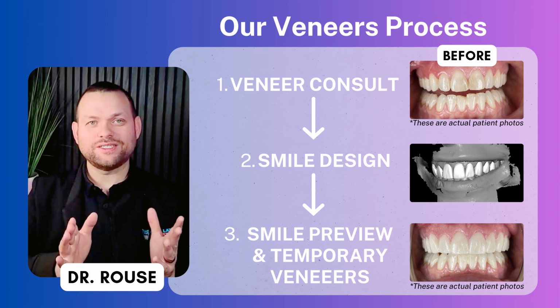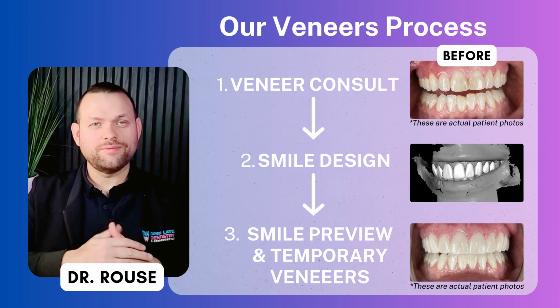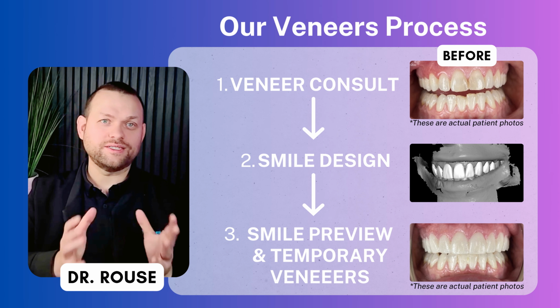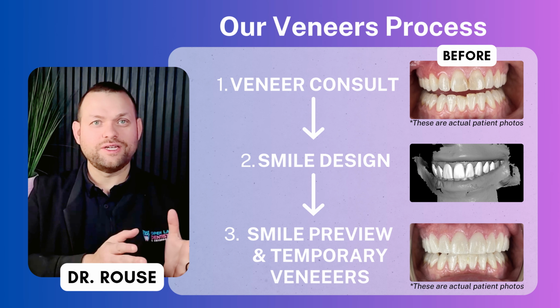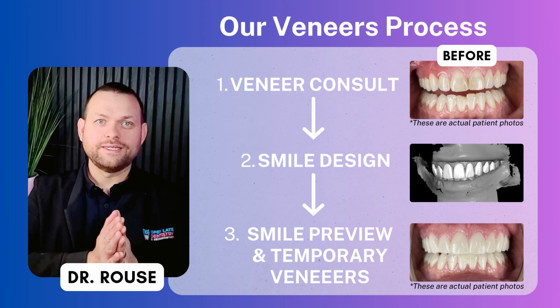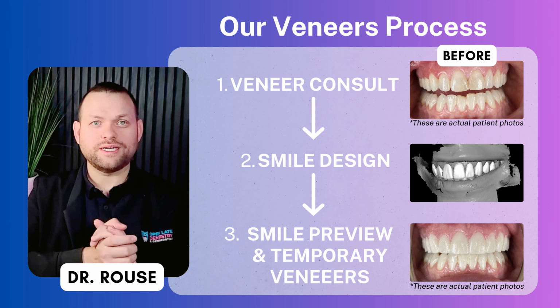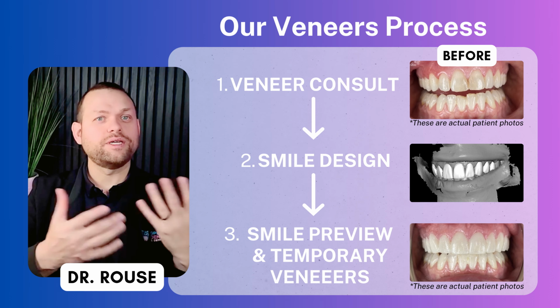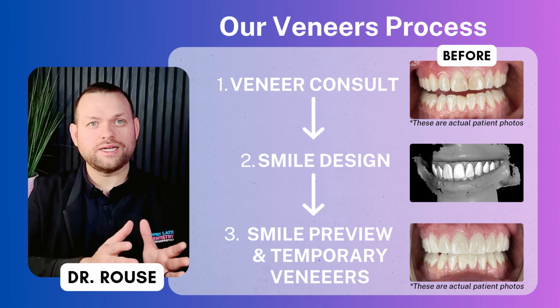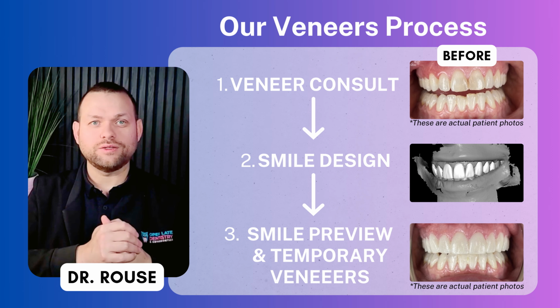The easiest way to do this is to just go through an example. So I want to show you a real life case of someone who came in and was considering dental veneers, and these are the steps we took. So we did a veneer consultation and showed the patient a mock-up of what their teeth could look like. Then the second step was taking that 2D picture and turning it into a 3D design. And then the third step was the actual big reveal day. That's where we took that 3D design, transferred it to the patient's teeth, and showed them exactly what their smile was going to look like. We call that the smile preview. So let's get into the details of each one of those steps now.